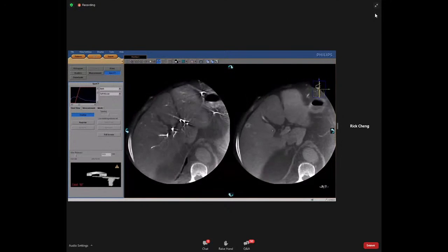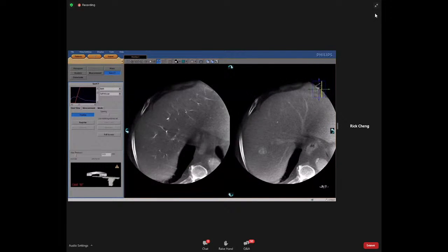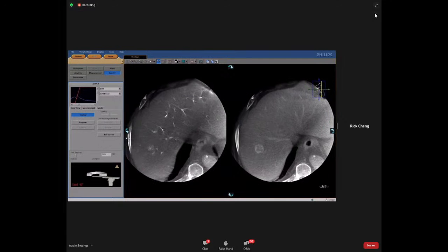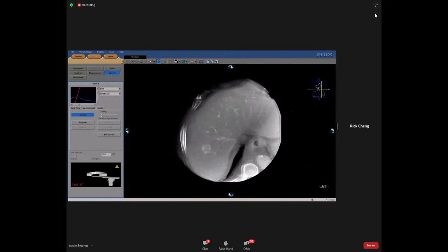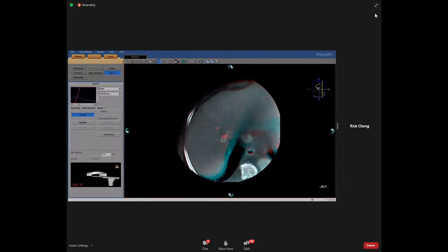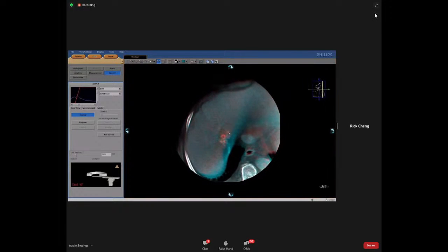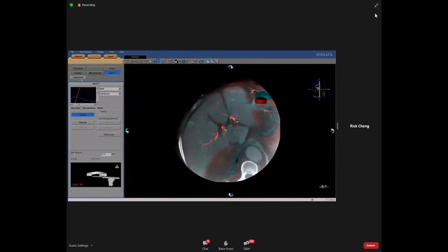Zoom the volumes and scroll through both volumes to check if all structures are clearly visible and to check if all lesions are in the volume. If you're satisfied with the result, you can merge the arterial and late phase with the spacing slider and scroll through the volume to check if both volumes are matching.